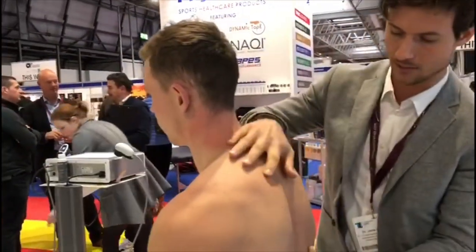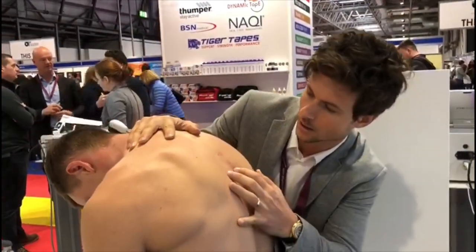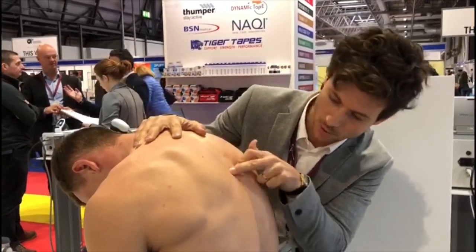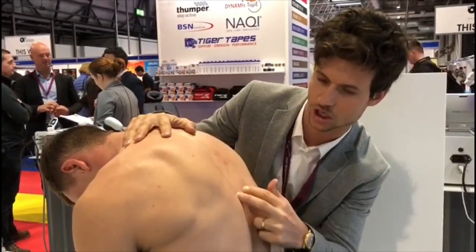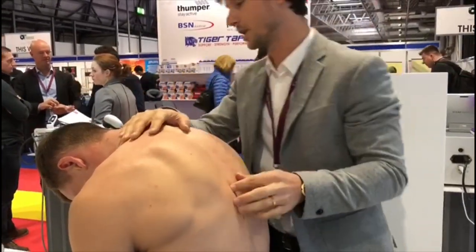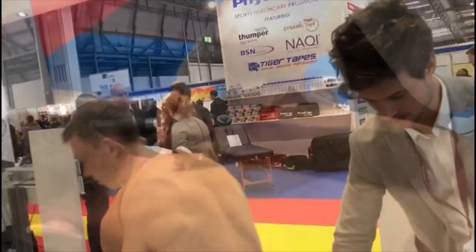All right. Let's see if you flex now and see if we can get any more movement. All right. So we increased the movement, I would say down there approximately. It's still a little bit stuck in this region, but I will try to treat a little bit more. But then you have to lie prone. Yeah. Let's see if we can use this.